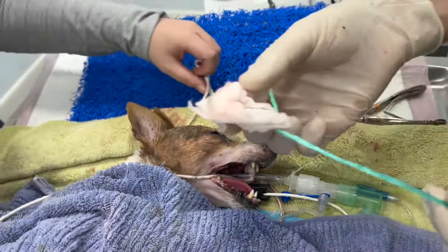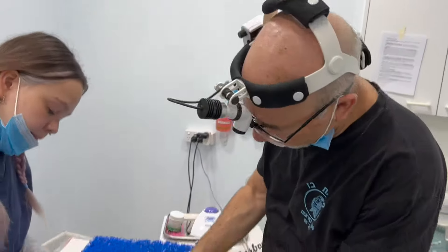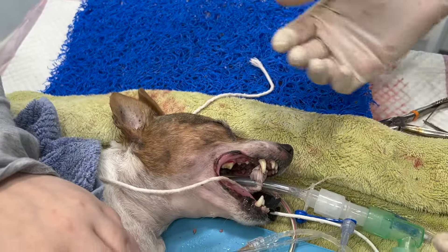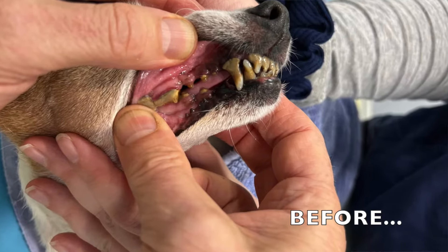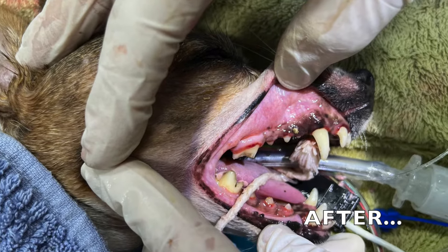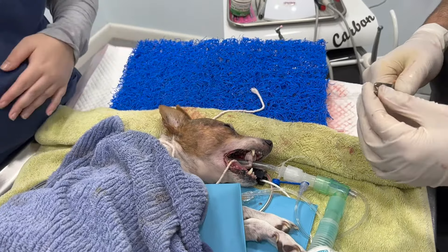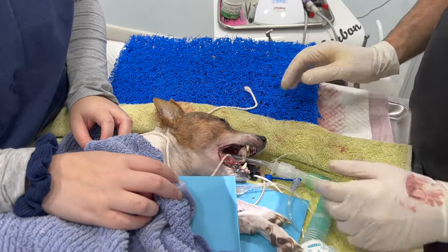This little guy is finished. We've pulled out the swab from the back of the throat. There is a second carnassial tooth that looks like it might have pulp exposure, but we can't do it in this dental — there's only so much you can do in an hour. We've taken out the five worst affected teeth, scaled and polished, cleaned the gums, and flushed the mouth. This little guy will be 85 to 90 percent better. Even if he never has another dental, he'll be a different dog in three days — he's had an antibiotic, some pain relief, and we're very happy with the outcome.